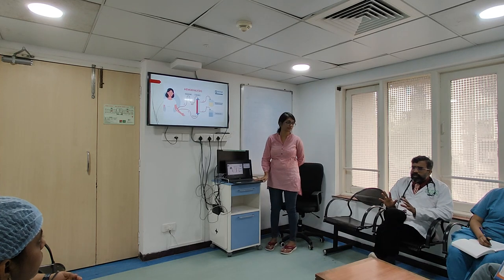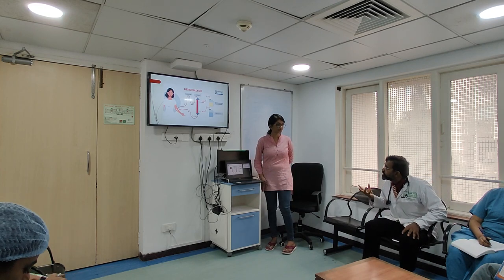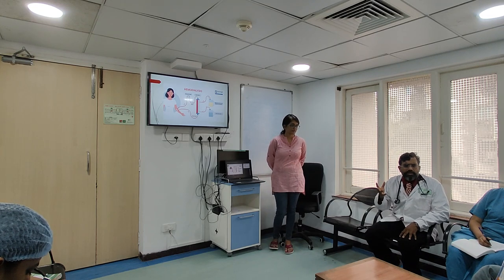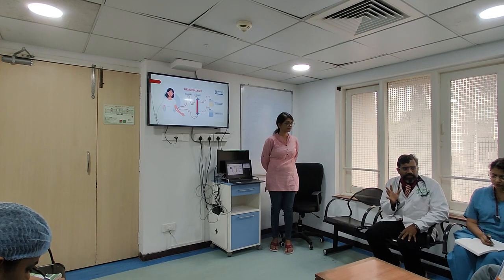So in intermittent hemodialysis, what have you understood? That it is first of all a very short term therapy, isn't it? It's a very, very short term therapy. When you do intermittent hemodialysis, it basically lasts approximately 2 to 4 hours.